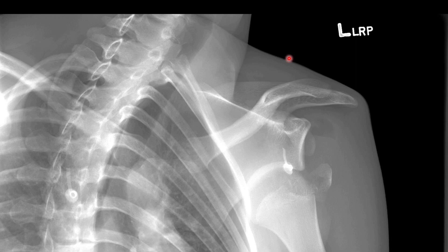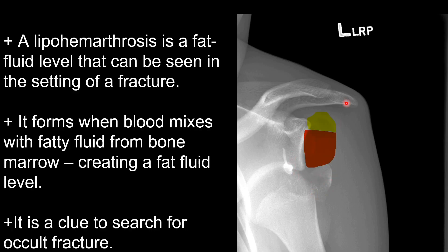Here's our first case. We have an anterior shoulder dislocation with an associated fracture as well as a fat fluid level. A lipohemarthrosis occurs when fat and blood from the fractured bone mix in the joint space and create this differential fat fluid level. In cases where we have a known fracture, the lipohemarthrosis is less useful. However, in cases where we do not see a fracture, the lipohemarthrosis should clue us into the fact that there may be an occult fracture.